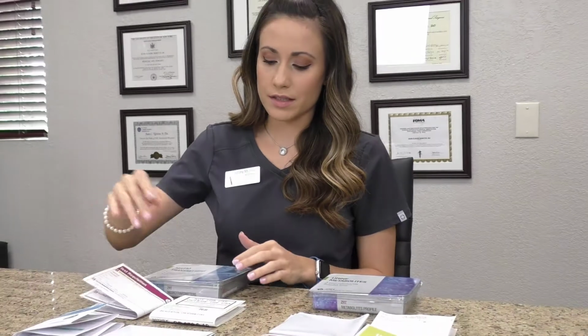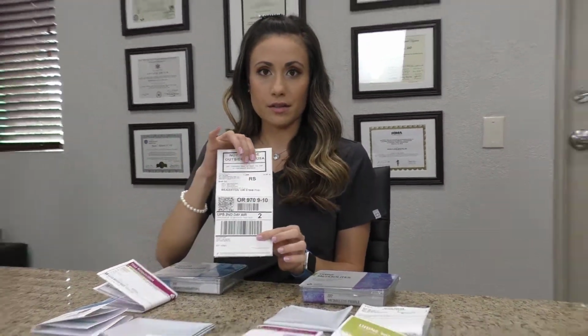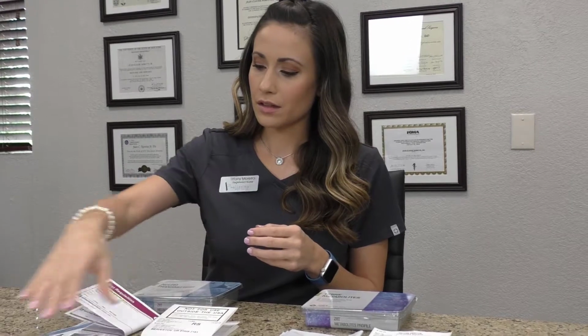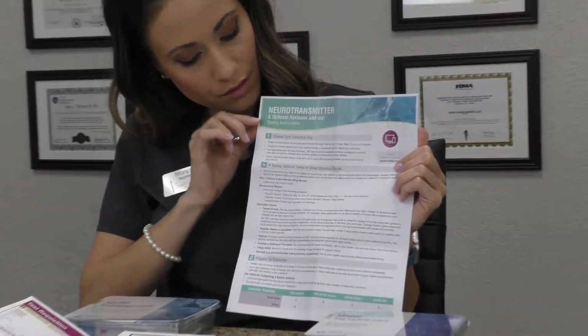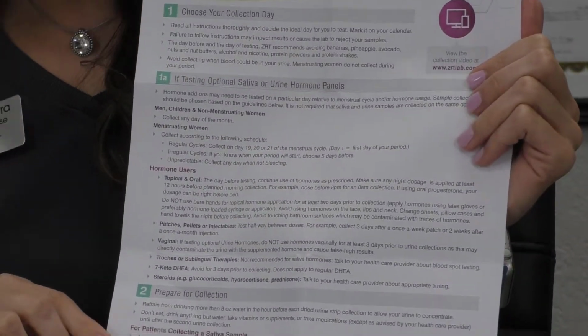In the test kit, we also have a label that will be going on the outside of the bag, the bag that we put the test kit inside, with the label right on the front. We also have the form showing us exactly how to take the test.